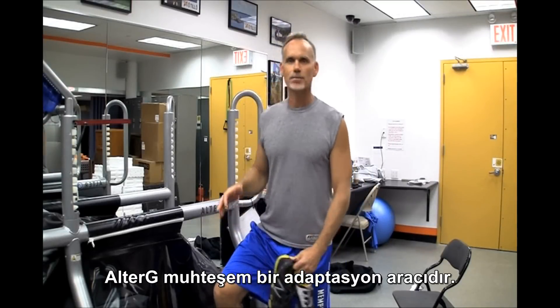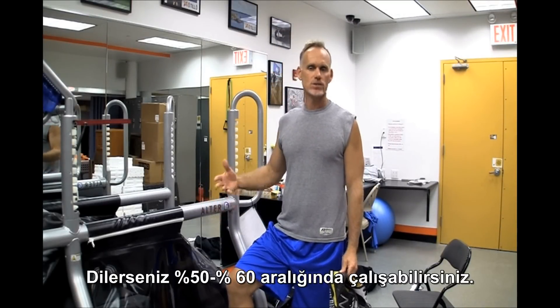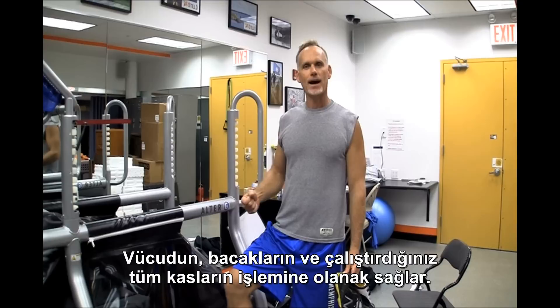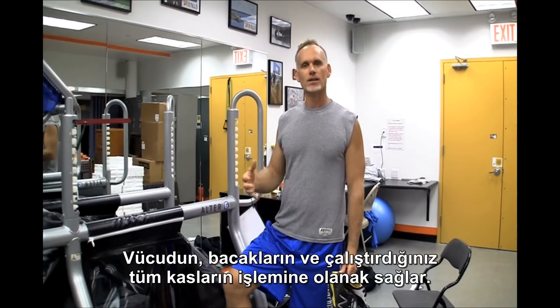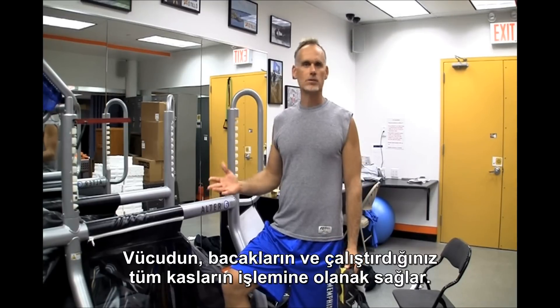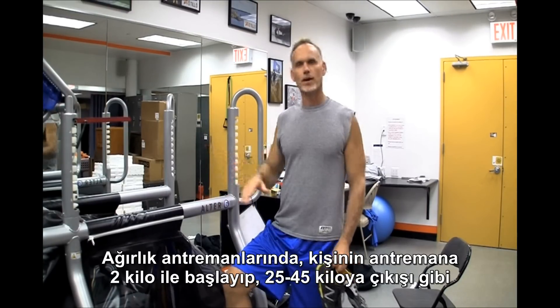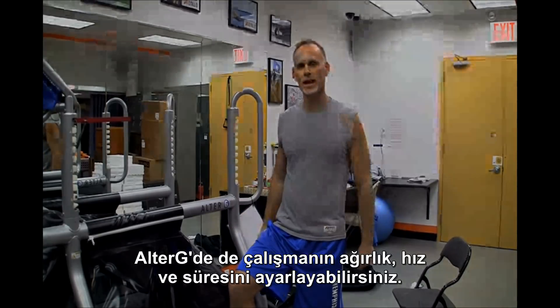The Alter-G is a great adaptation tool where you can work at the 60% range, 50%, let the body break in — the foot, all these new muscles that you're working. And then just like weight training, a person starts with 5 pounds and they progress to 50 or 100 pounds. You can change the amount of weight, the volume, and how much time you're doing on it.